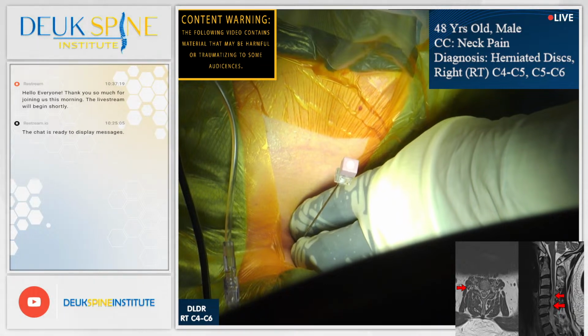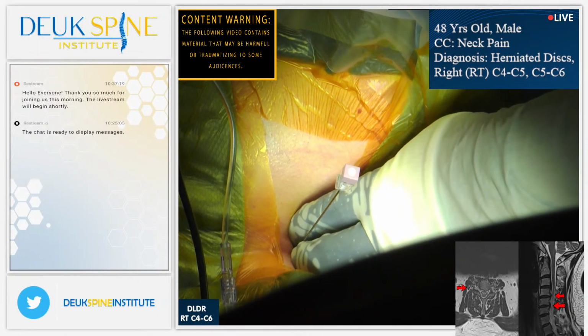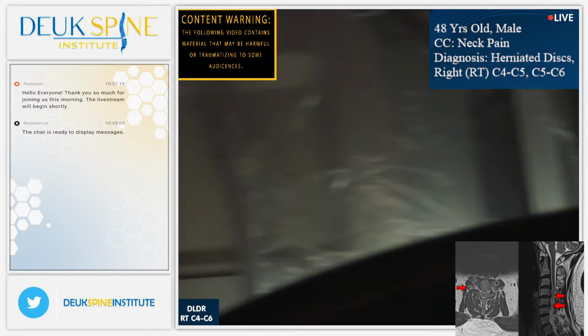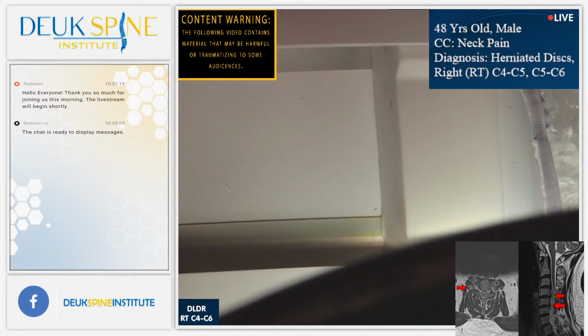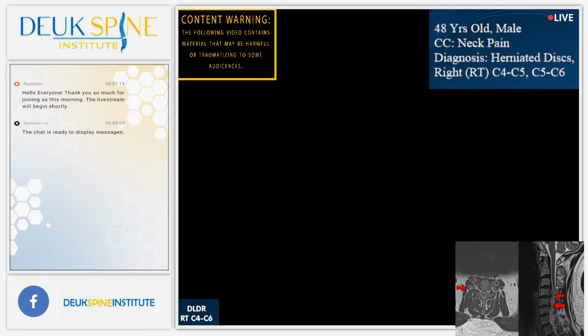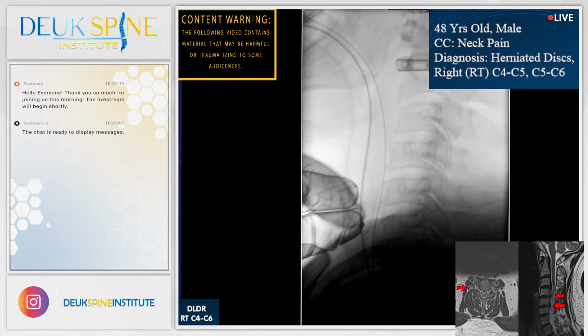You can see from our video, AP, why discs cause neck pain. It has to do with inflammation. Shot. All right, lateral. So what I need to do is place this needle in his disc through the front. Shot. All right, we're going to start with number 5-6.